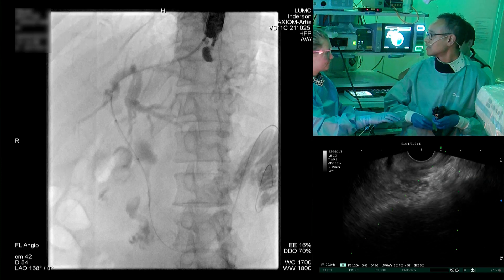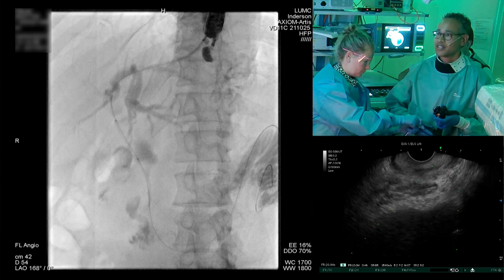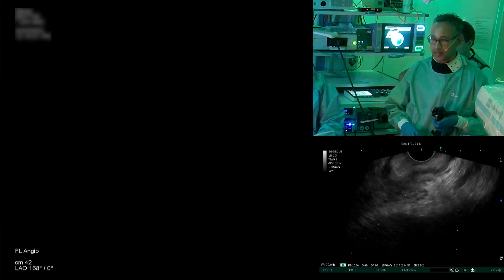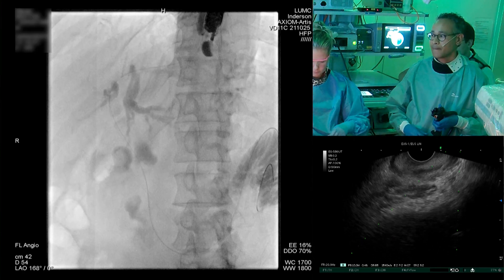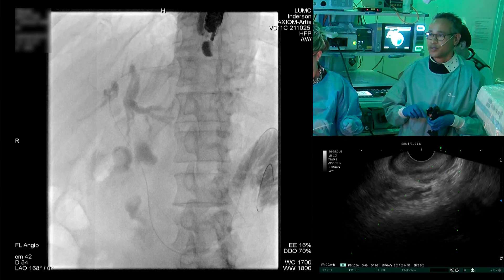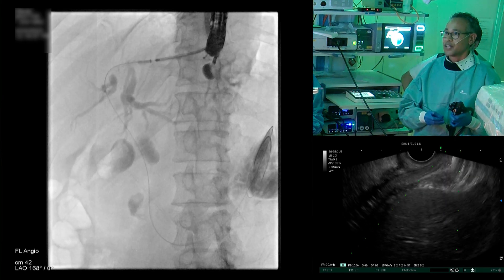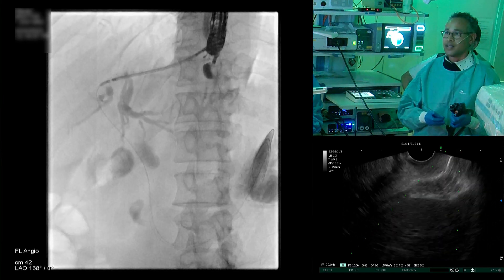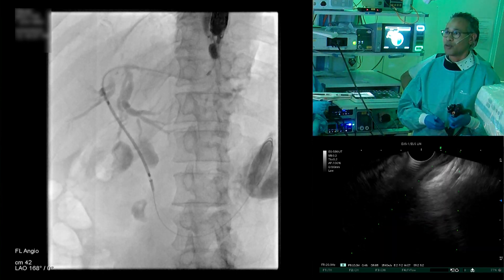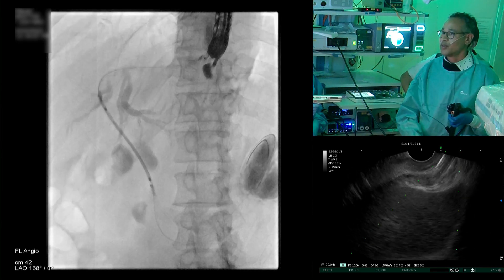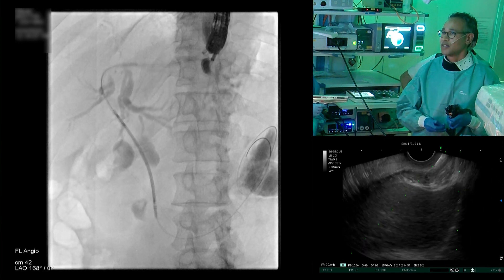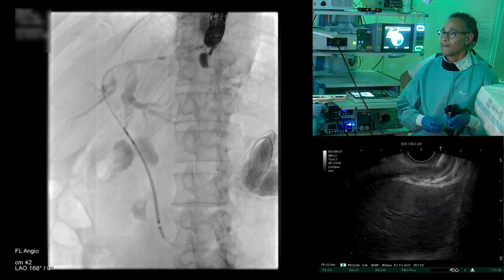We're going to use an uncovered 6cm, 10mm stent — uncovered in this case. I think the chances of a fully covered stent migrating, the difficulties of replacing it, and the high probability that this is a malignant tumor justify use of an uncovered metal stent. The stent is firmly affixed to the gastric wall, and here you see the stent delivery system following the guidewire smoothly. We have to be careful not to create too much space between the endoscope and the liver — but we're through.